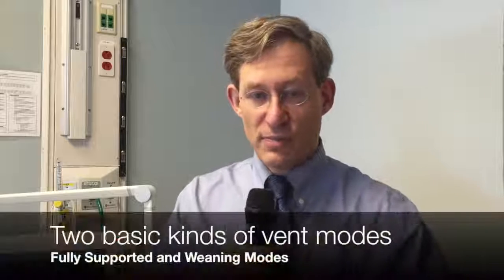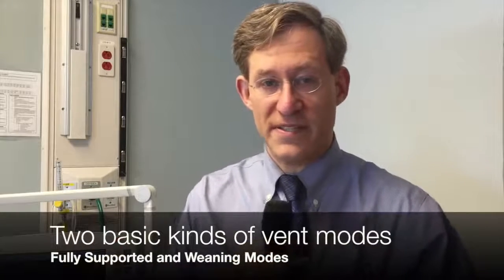Some of the downsides are you're not dialing in a particular tidal volume. However, that having been said, most modern ventilators have a minute ventilation alarm that if your minute ventilation goes too low, it will alarm and click into a fully supported mode. So from our perspective, there are two kinds of ventilator modes: fully supported modes, such as assist control or PRVC, and weaning modes. And the weaning modes that we've described are three major modes that can be used during spontaneous breathing trials, including pressure support ventilation, formal CPAP trials, and T-tube trials.